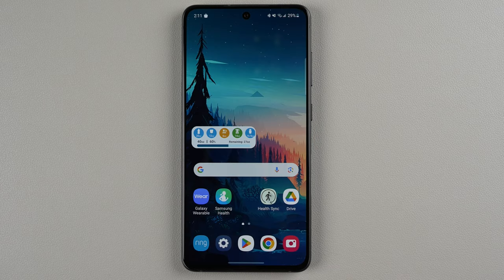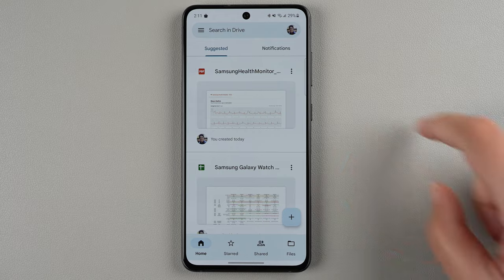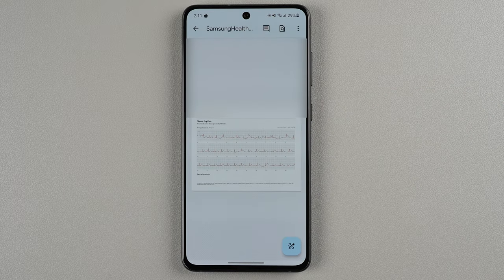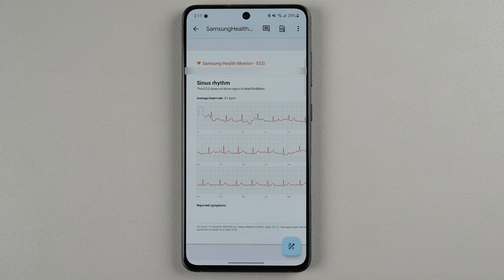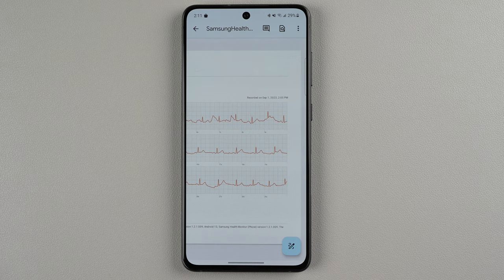Now I'm going to go to my Google Drive — there we go. I'll tap here and it looks like this is the Samsung Health Monitor ECG. This is information that you can give to your doctor, and it also gives you the date and time on the PDF.